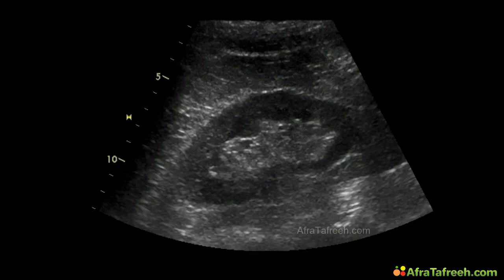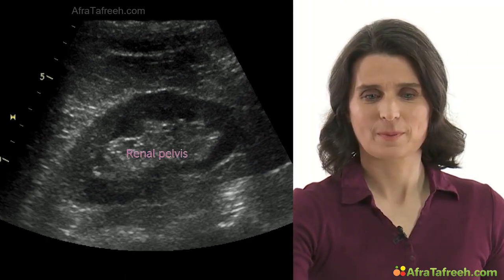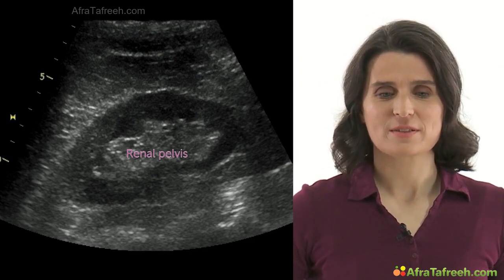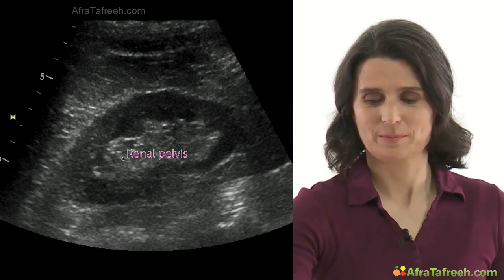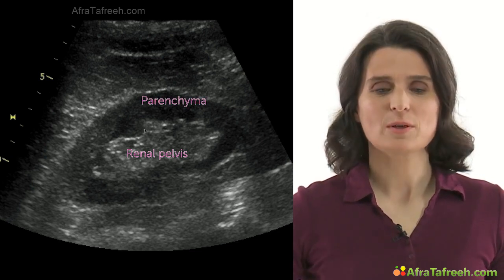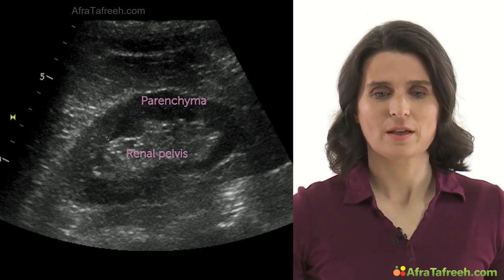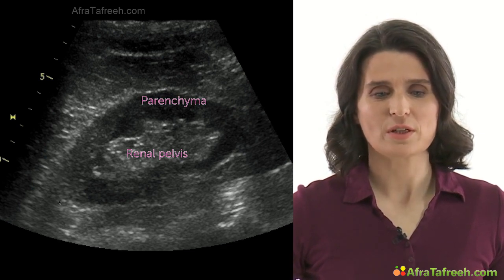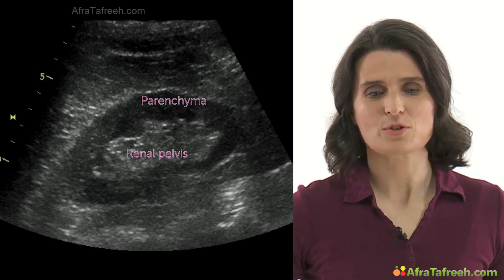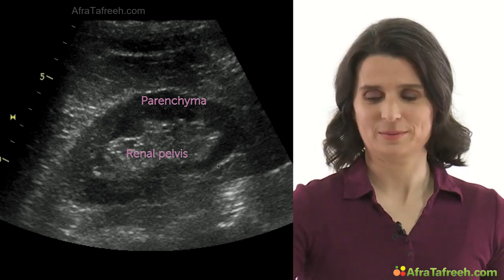In this picture, we can see a longitudinal plane of the right kidney, the renal pelvis in the center, bright and hyperechoic, and the renal parenchyma here at the outside. We can also distinguish the renal capsule, also hyperechoic, over here.